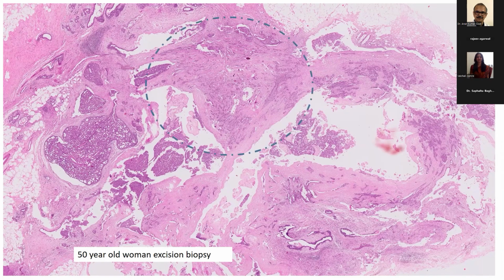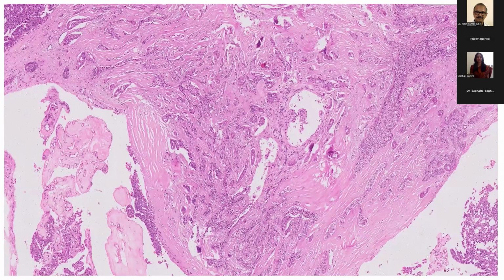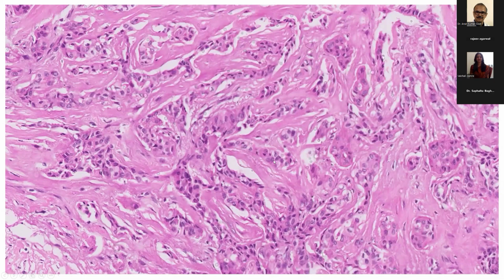So we just looked at it. It was a little scary lesion. Yes, it looked micropapillary, it looked invasive, infiltrating at all. And then suddenly it struck me that this is after all a papilloma. It can do very weird things.